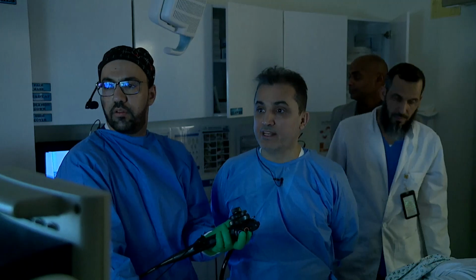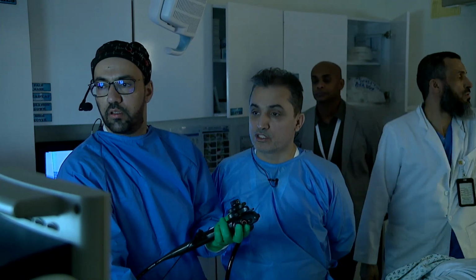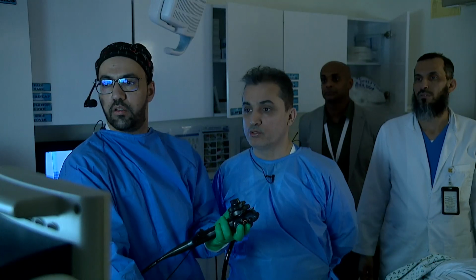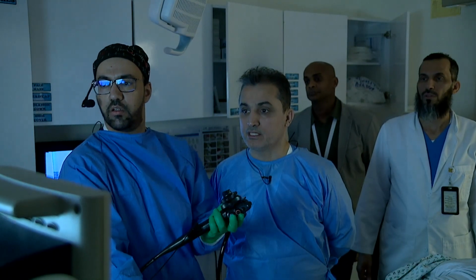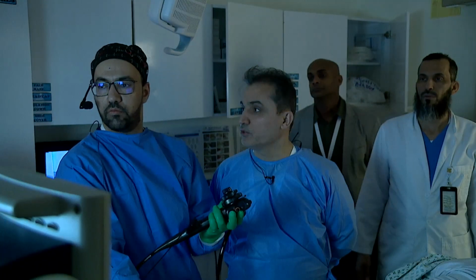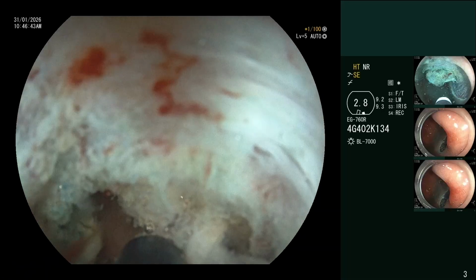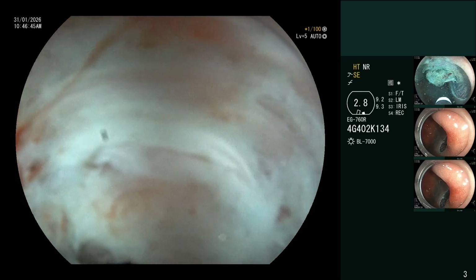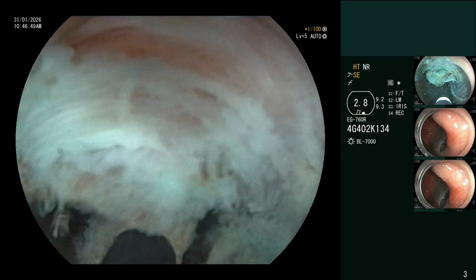We are in the final step of our procedure. This is the final cut of the lesion, which is very difficult, so we were obliged to use the IT knife nano for cutting, an isolated tip knife. I think you did a great job. Actually, you did it; I just got the last part of the lesion. We don't have any muscular defect, so no major bleeding.